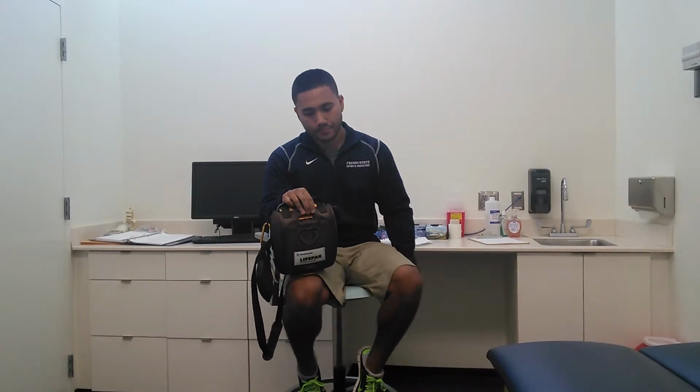While you send that person to get the AED, you're going to want to perform CPR on the patient until the AED arrives. Also, make sure to send someone to activate EMS. While waiting, you'll be doing that CPR, and once the AED gets there, you're going to want to clear the area.